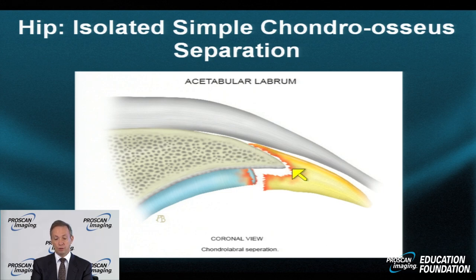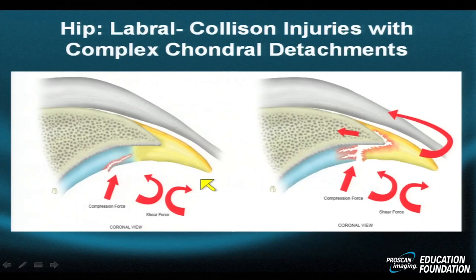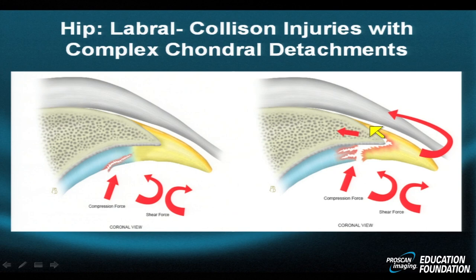Here's an example of a labro-acetabular separation — some refer to this as a chondro-osseous separation. The separation may include fibrocartilage from bone, fibrocartilage from hyaline cartilage, or fibrocartilage from both. Occasionally you will even see the capsule come off as well — a so-called triple separation. Complex forces may produce irregular tears involving the margin of the hyaline cartilage, resulting in separation of the fibrocartilage from both the hyaline cartilage and the bone, with concomitant capsular separation.